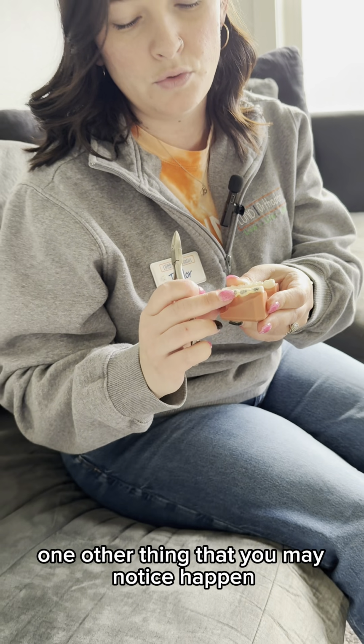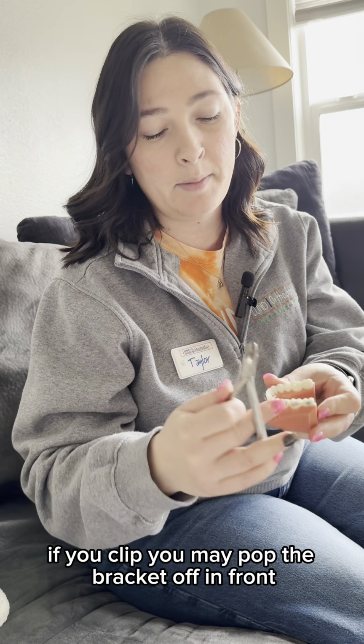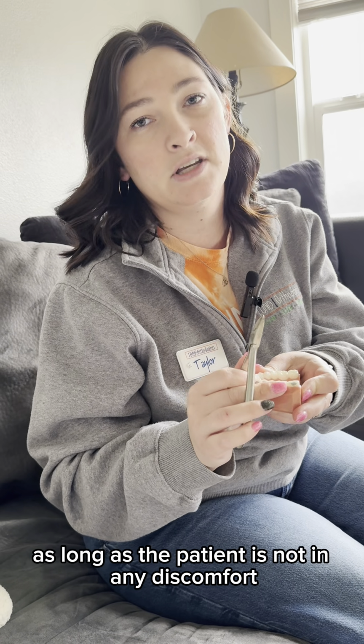One other thing that you may notice happen is when you get really close to that next bracket, if you clip, you may pop the bracket off in front. However, it is okay as long as the patient is not in any discomfort.